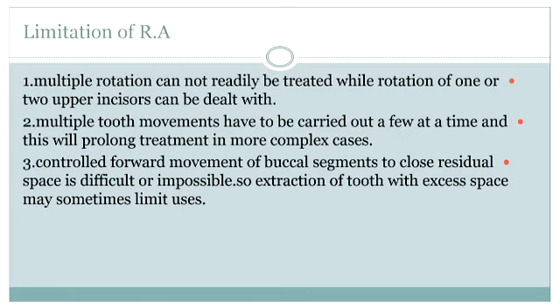Therefore, multiple tooth rotation and multiple tooth movement at the same time are limited with removable appliances. Controlled forward movement of the buccal segment to close residual space is difficult or impossible, so extraction of the tooth with the excess space may sometimes be of limited use.